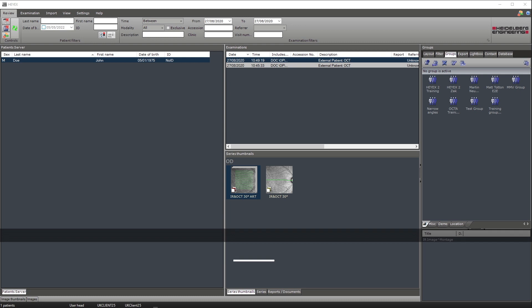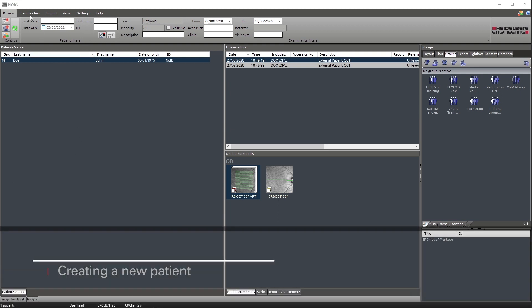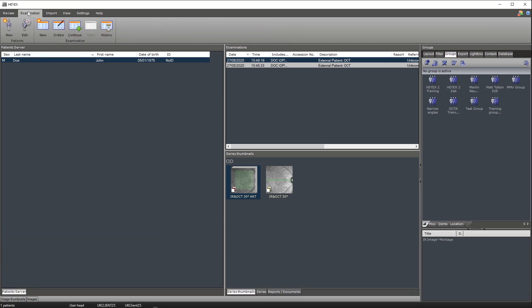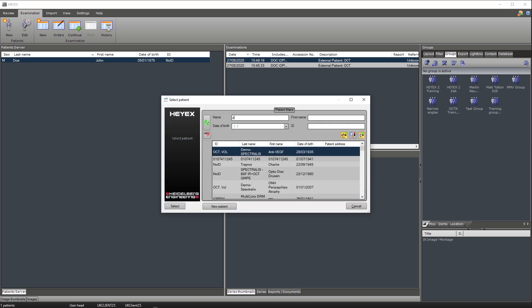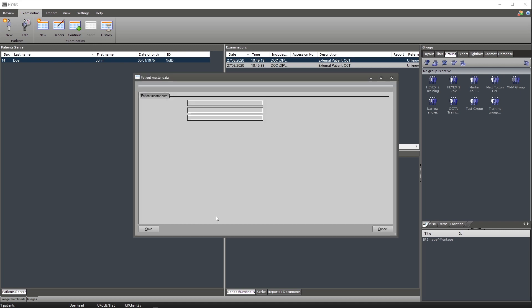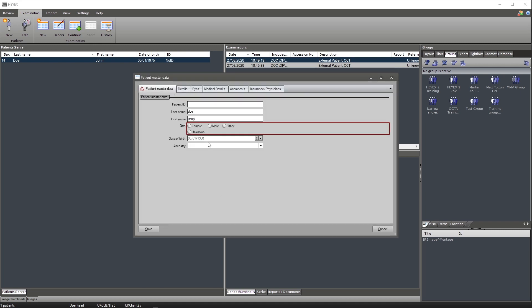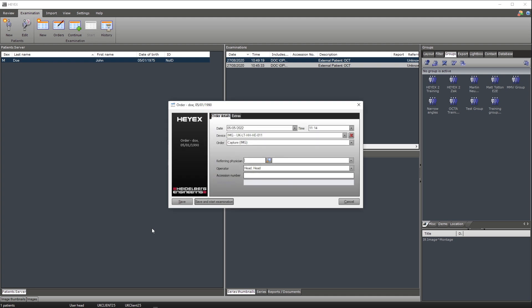To create a new patient within the HIAC software, select the examination tab on the ribbon bar. The first icon running from left to right is new with a star. Select this icon to create a new patient. It will ask you to research the patient server to make sure the patient doesn't exist. Select new patient if the patient doesn't exist and fill in the patient master data. Once the data is inputted, select save and then click save and start examination on the order.